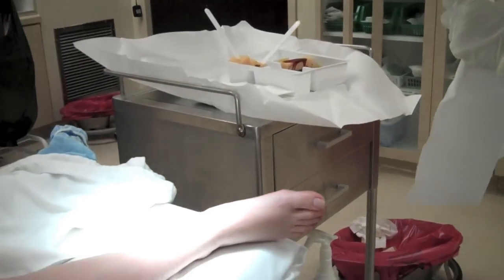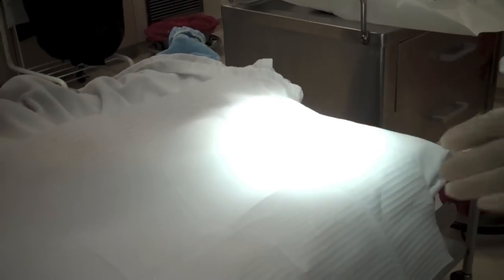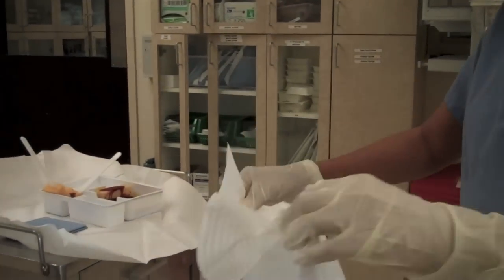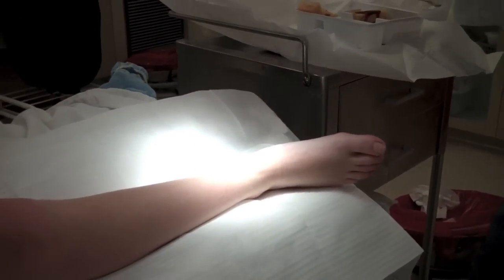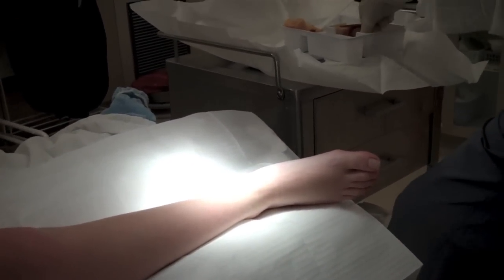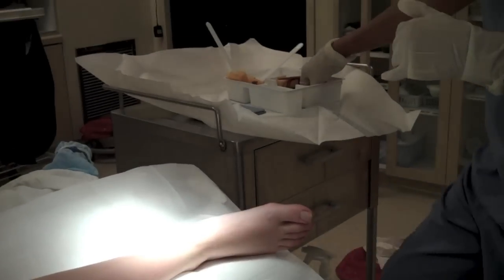We're going to put a sterile drape under his leg. Once I get started, I can't put his leg back down once I pick it up.